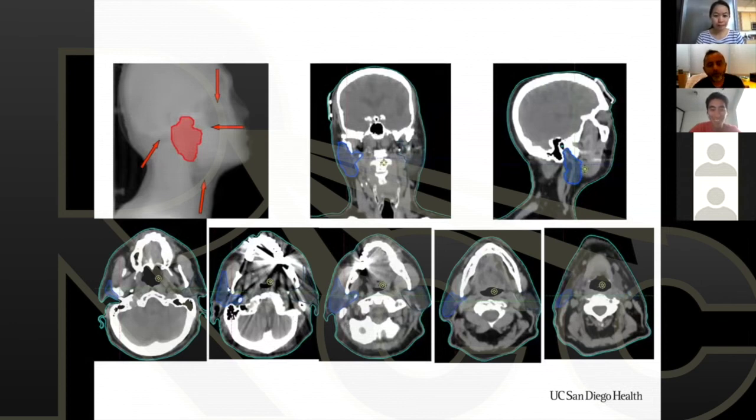Okay, perfect. So again, showing you, here you can see the mandible, here's that masseter muscle, and here's that accessory tail of the parotid gland. This is the one common pitfall that I find my residents don't realize to contour. They do a very good job of contouring the superficial lobe, but sometimes they miss the deep lobe, but here's that accessory tail right there.